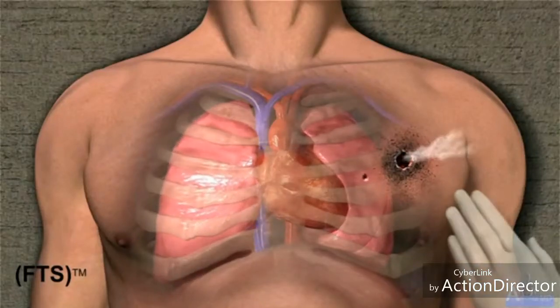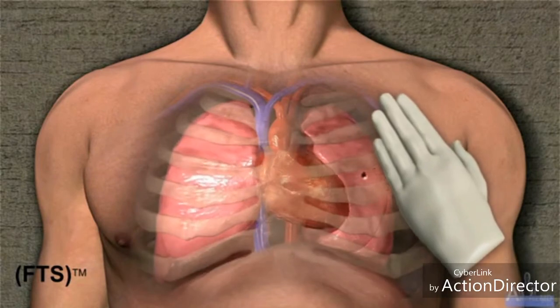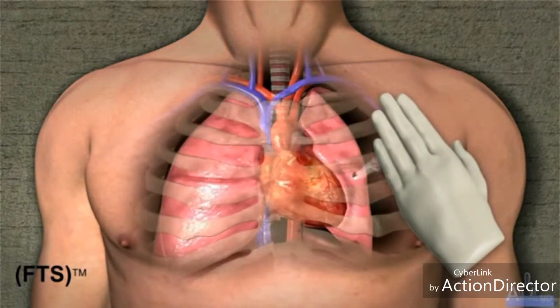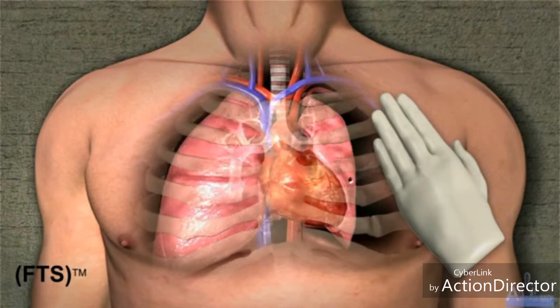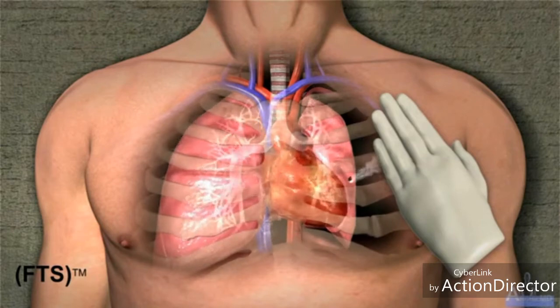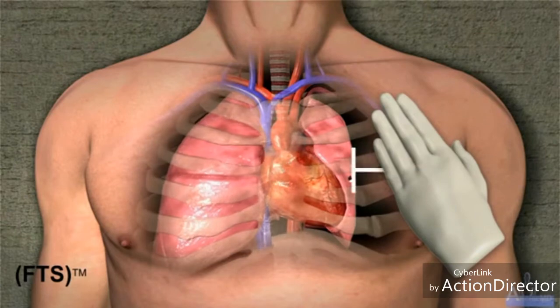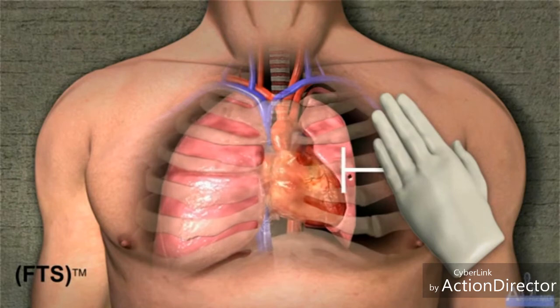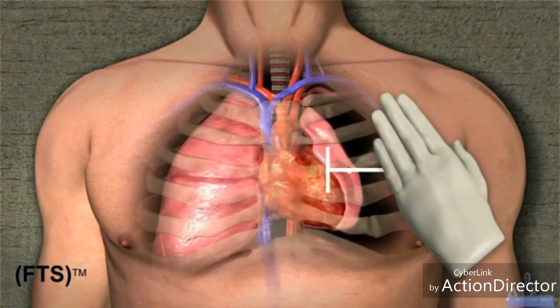As demonstrated here, occluding the chest wound causes air to follow the normal pathway, the trachea. Some of the air entering the injured lung is now expelled into the pleural space and is trapped. A tension pneumothorax occurs when this trapped air causes progressive accumulation of pressure in the pleural space and collapses the injured lung and may push the mediastinum to the opposite hemithorax, which would compress the heart and other lung.